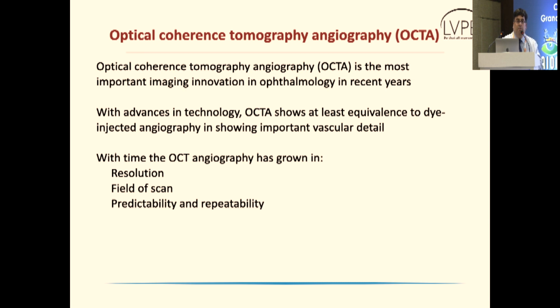A lot of pre-treatment protocols are now based on OCT angiography. Slowly and steadily, it is trying to replace other forms of imaging. It's becoming a replacement for dye-injected angiography in quite a few scenarios. And as time has gone, OCT angiography has grown in resolution, field of scan, predictability, and repeatability, and the number of artifacts has reduced. All those have improved.